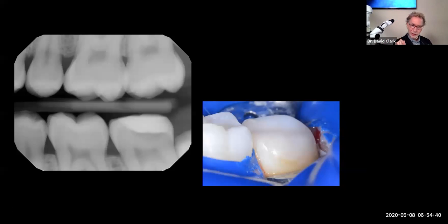And the body will actually sterilize that, pain-free, inflammation-free, naturally. That is natural dentin healing, because I'm going to show you in a minute the histology of why a healthy pulp can mineralize that over the next 10 years and have zero pulpal pain. This patient has zero pulpal pain, zero. Mom is ecstatic. Patient is excited.